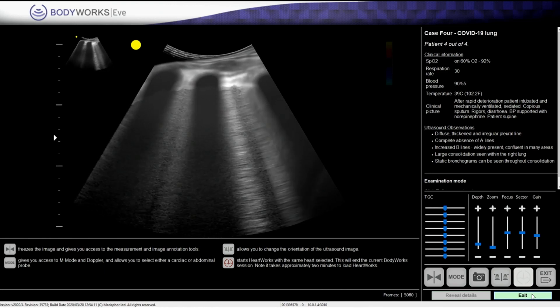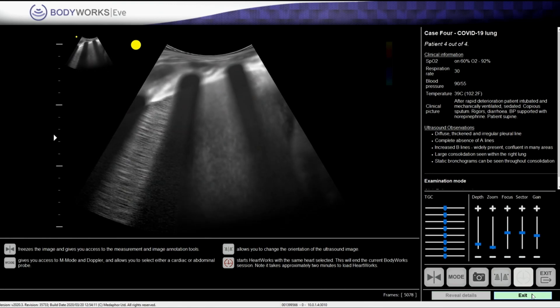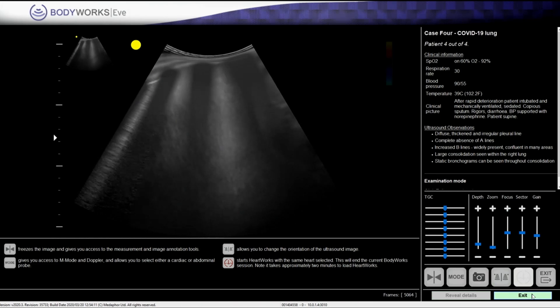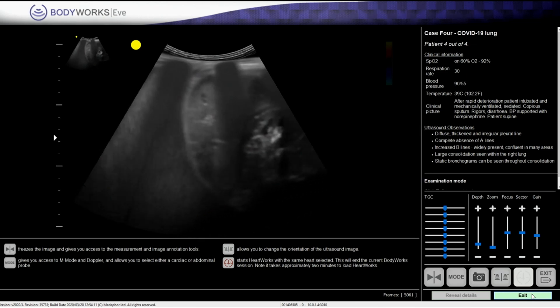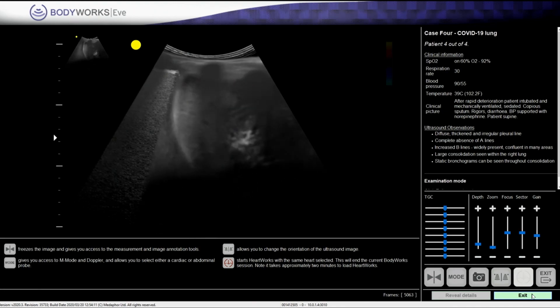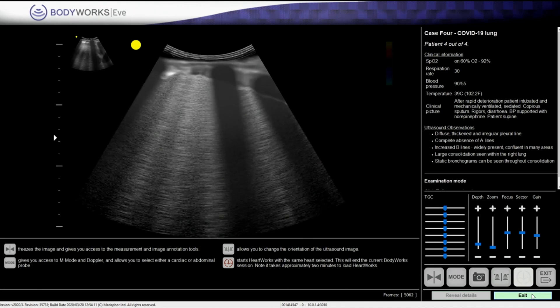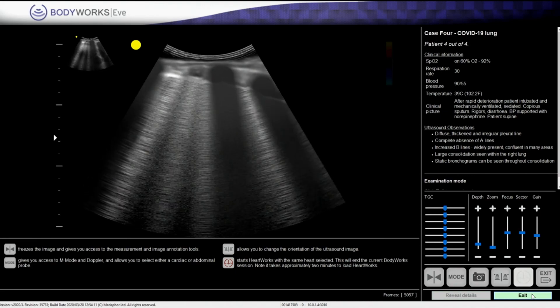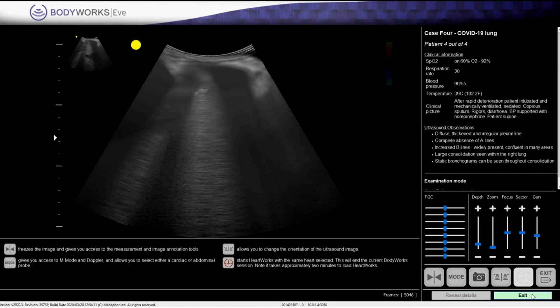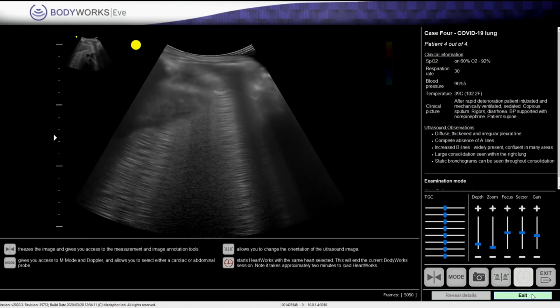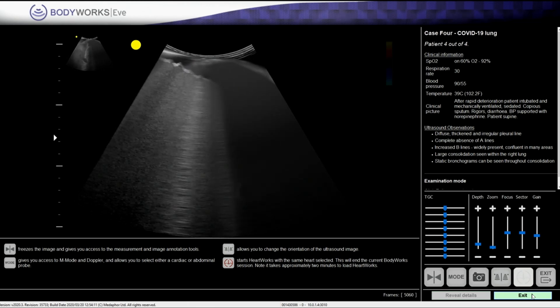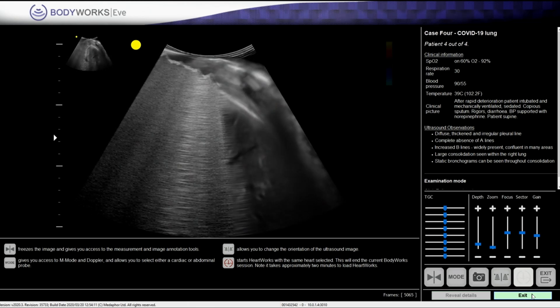Scanning from the left anterior chest down toward the spleen, you see a lot of B-lines, rib shadow, and a thickened pleural line. Moving down to the subphrenic region and diaphragm, you see the spleen with no effusion but lots of B-lines. Moving cephalad toward the right anterior chest, you see the same B-lines with very thick pleural lining, and starting to see consolidation around the lateral base. At the right upper quadrant, you see subcostal consolidation.